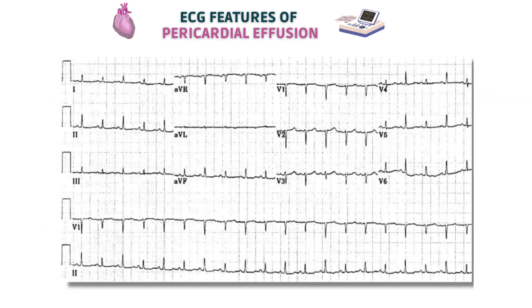Here is an example ECG from a patient with a large pericardial effusion. You can appreciate the low-voltage QRS complexes, especially in Lead 3 and AVL. Looking at the rhythm strip in Lead 2 at the bottom of the ECG, you can also see that alternate QRS complexes are short and tall. This is a classical example of electrical alternans.